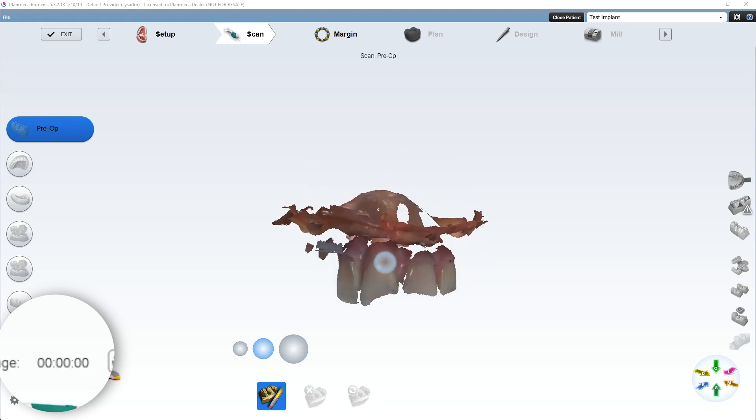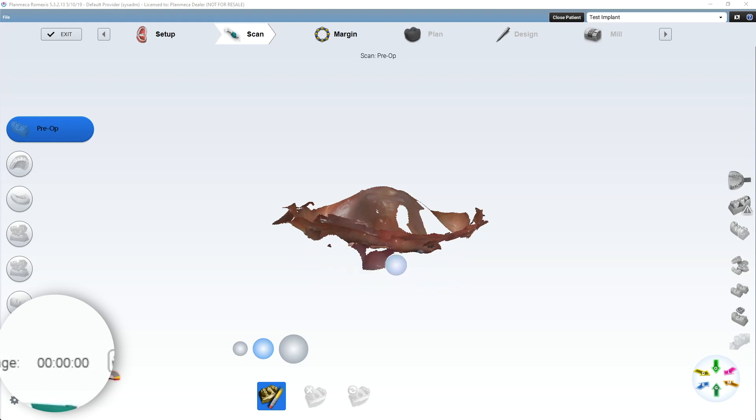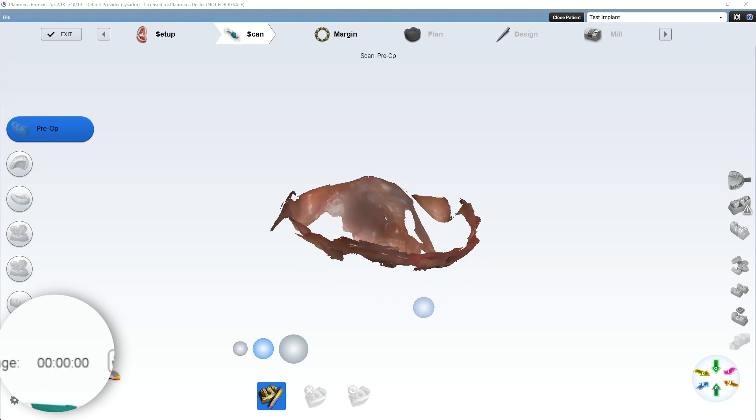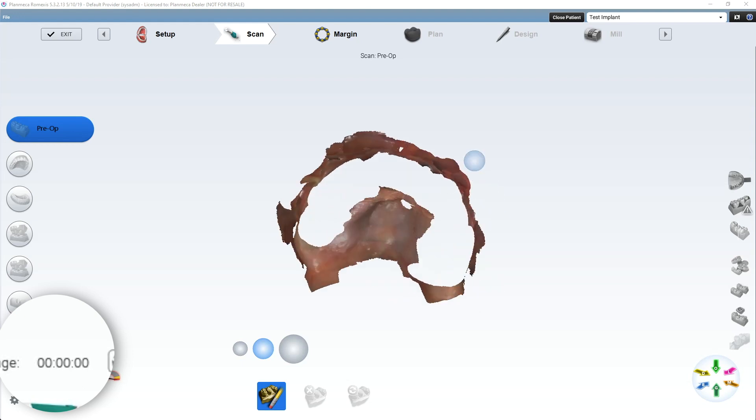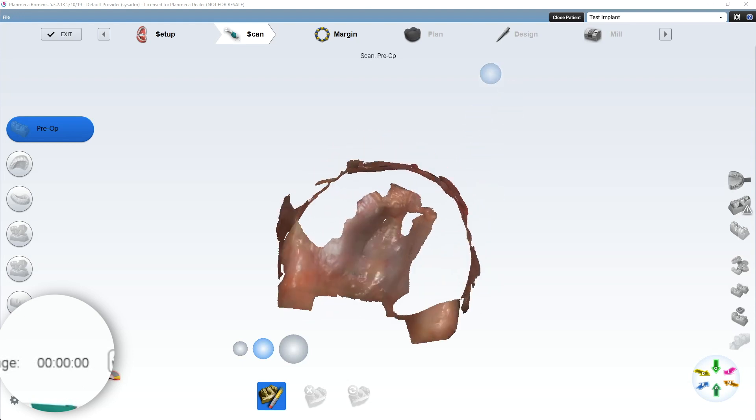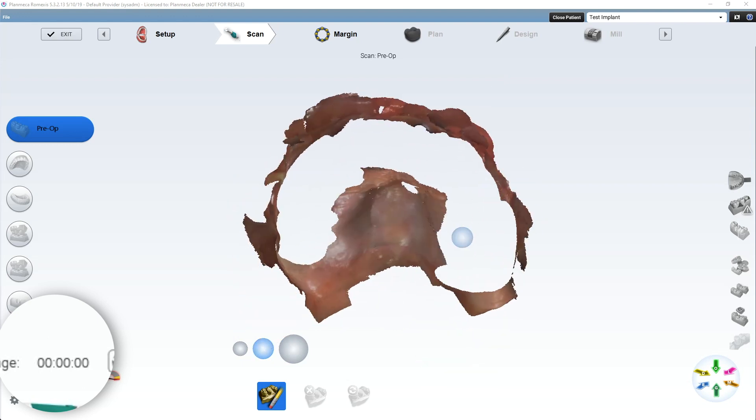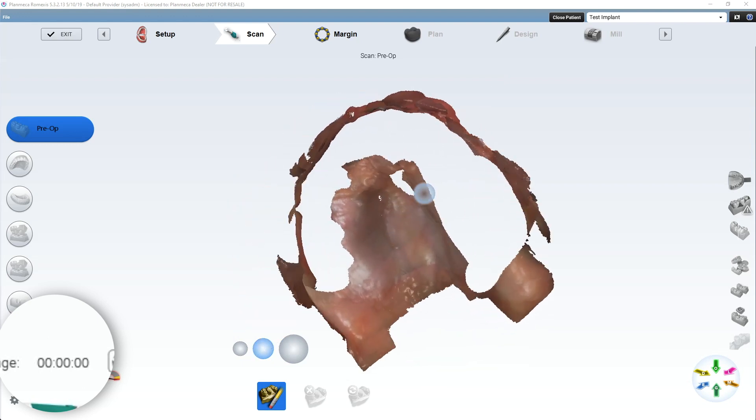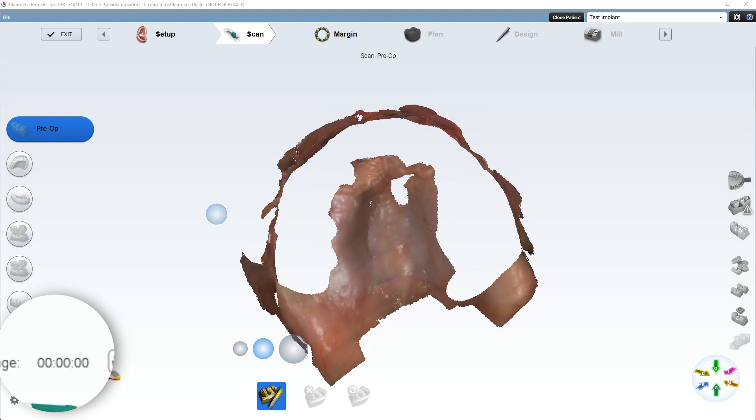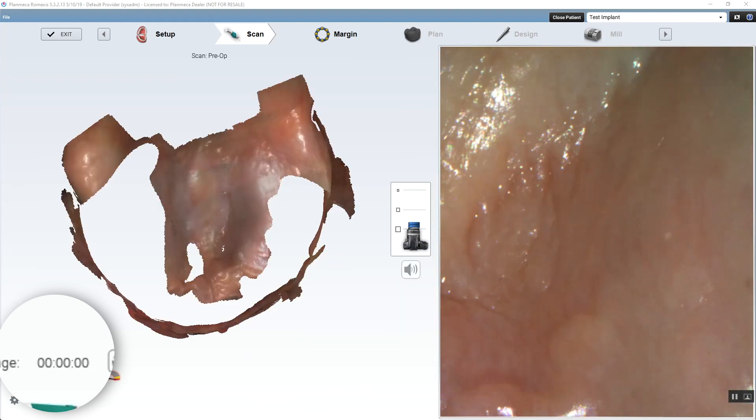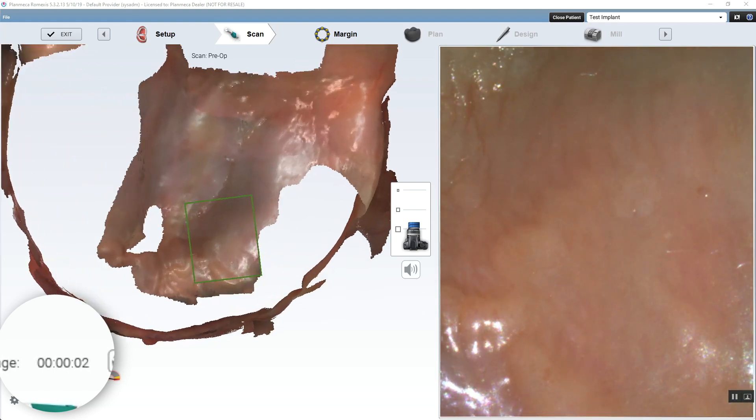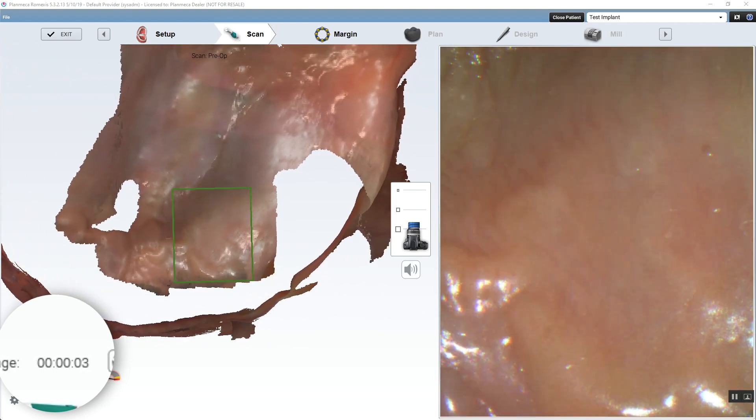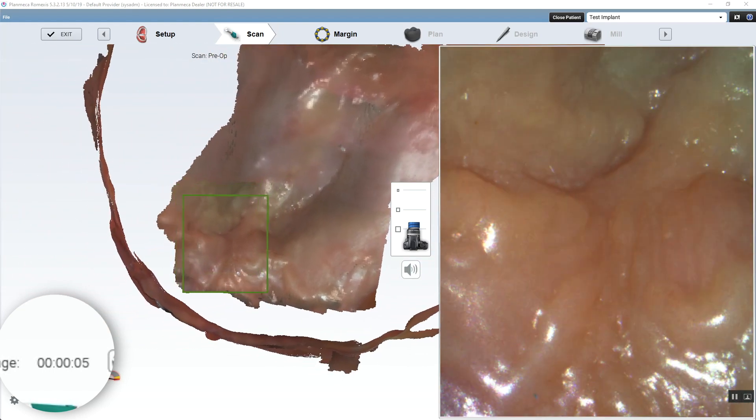And you're going to see how butter smooth this thing is going to scan these multi-units. And once again, the reason why we're doing this is because this mesh here is merged to the provisional mesh. Which then means when I scan these, it's going to be merged to the bite in space. So it's kind of hard to understand if you're not kind of understanding. So at the end, we'll kind of do a little review. So now, I'm starting on the palate and letting it pick up on the rugae there.